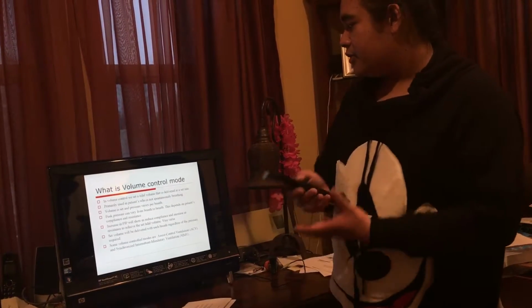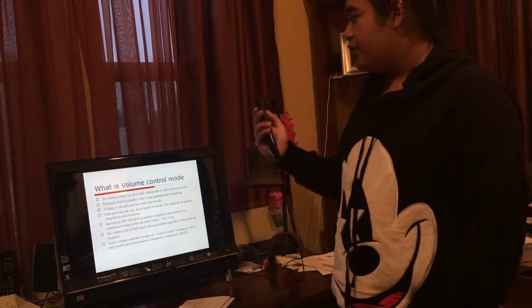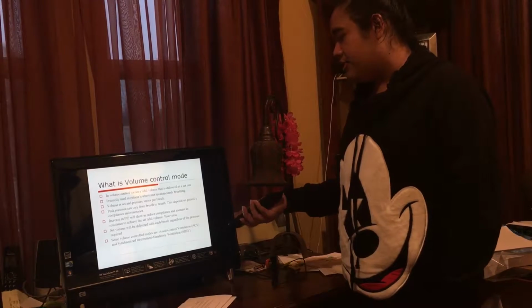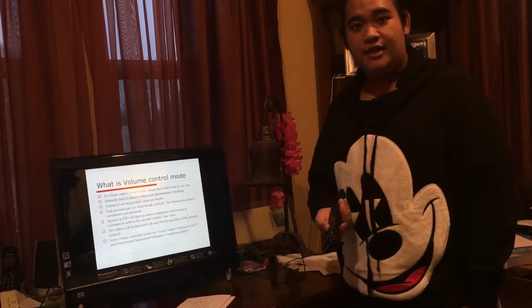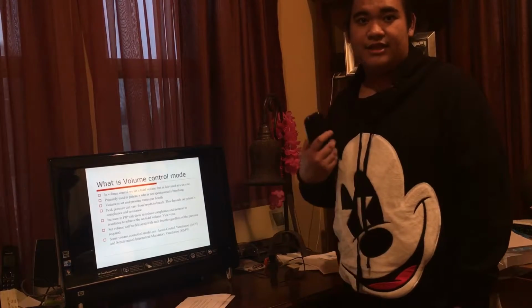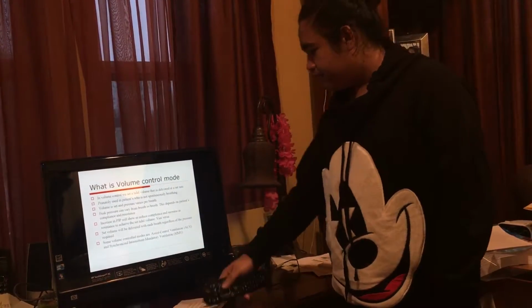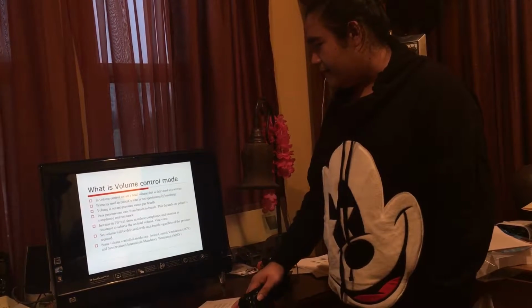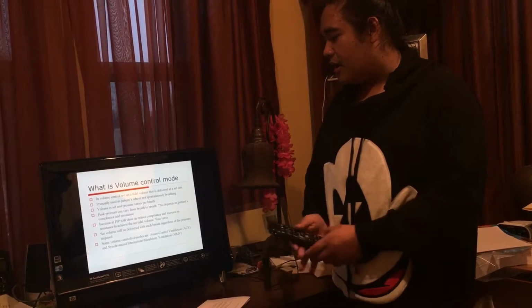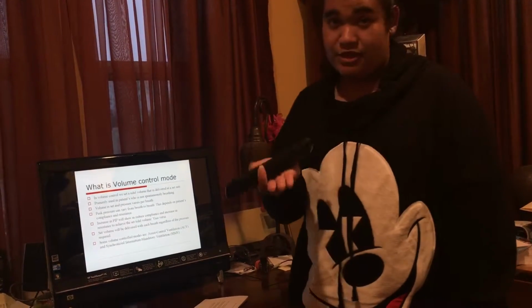Some volume controlled modes available for volume control are assist control ventilation, or ACV, or synchronized intermittent mandatory ventilation, or SIMV. I'm going to focus more on the assist control, and I'm not going to talk about SIMV at this point. That's for another lecture.